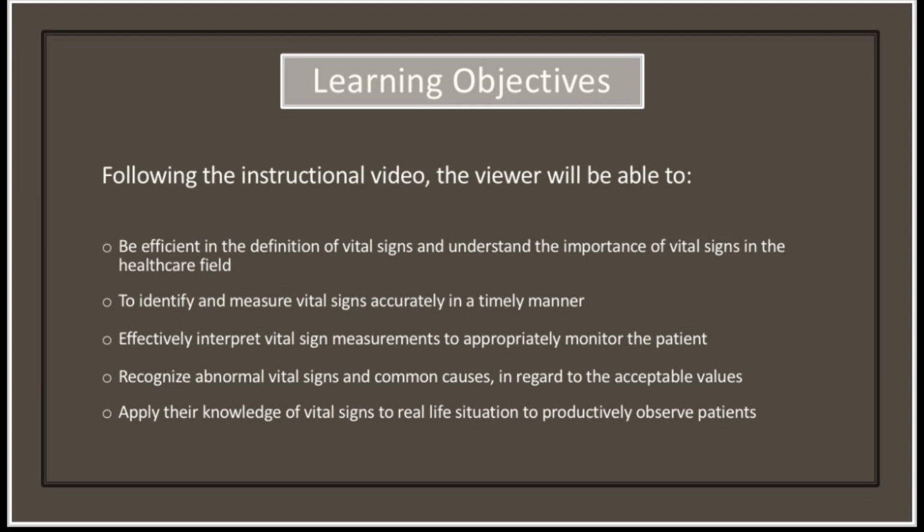Following the instructional video, the viewer will be able to define vital signs and understand the importance of vital signs in the healthcare field, to identify and measure vital signs accurately in a timely manner, effectively interpret vital sign measurements, to appropriately monitor the patient, recognize abnormal vital signs and common causes in regard to the acceptable values, and apply their knowledge of vital signs to real-life situations to productively observe patients.